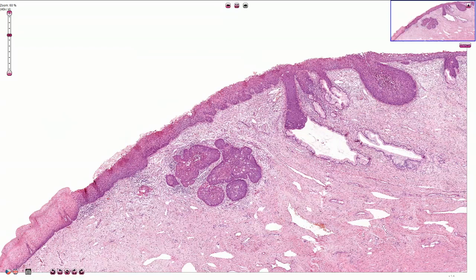Here we are looking at the biopsy from the uterine cervix, and this is part of the transformation zone. Here we have the exocervical or ectocervical non-keratinized stratified squamous epithelium, and here we have the endocervical component with the endocervical glands. This is the normal epithelium, and here we have the high-grade dysplasia in the squamous epithelium and also in some endocervical glands.